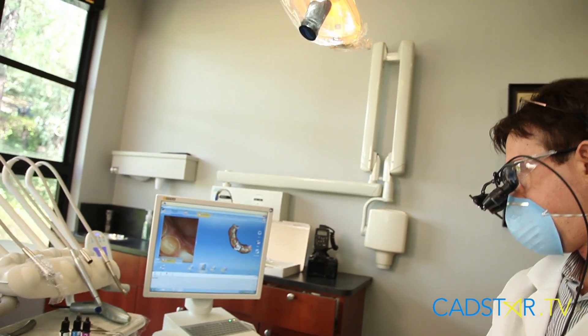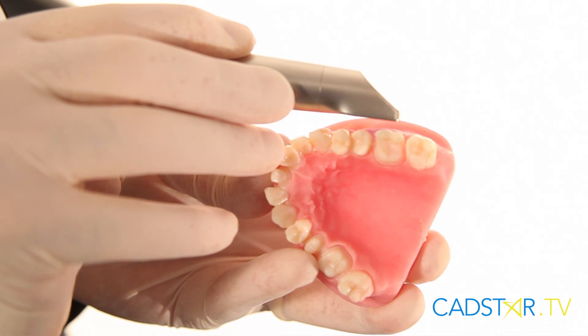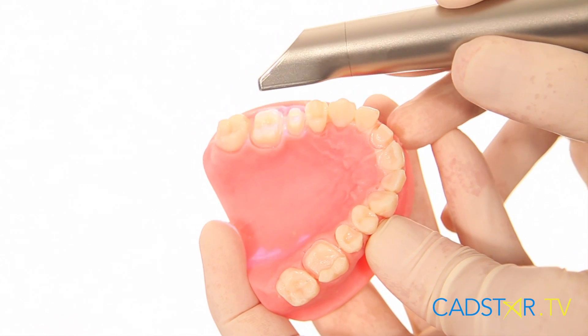I'm so excited about where we're going with CEREC and I'm glad to be on this journey and to be part of the journey with you folks as well. I'd like to review the case I did today as far as the scanning goes and the various techniques I use. I use the glide technique with a little pump in and out from the surface. It gathers information faster, and I use the hover and roll over our preparations. It's working extremely well and I think it will be a nice demonstration of how I see the Omnicam working very well in the mouth.